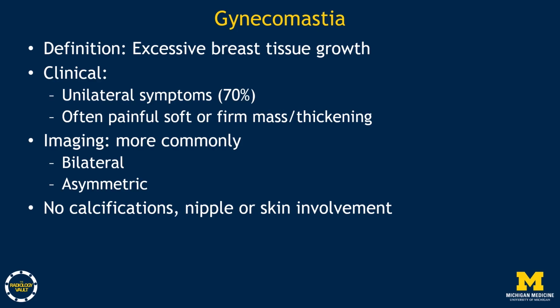Gynecomastia is defined as excessive growth of breast tissue. In the clinical setting, it presents as unilateral symptoms such as a soft or firm palpable mass related to the nipple or thickening of the breast tissue. On imaging, more commonly it is bilateral and often asymmetric. It's important to note that there are no calcifications associated with gynecomastia on mammographic imaging, and there is no skin or nipple involvement.